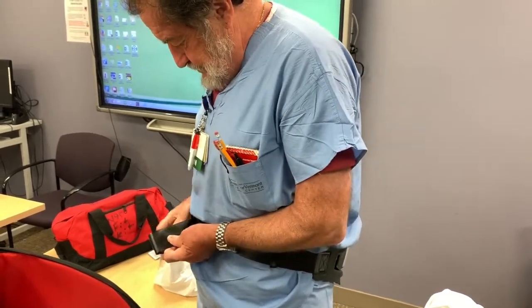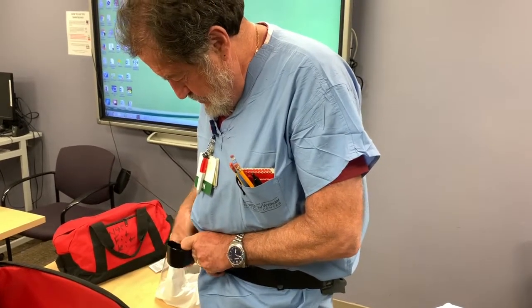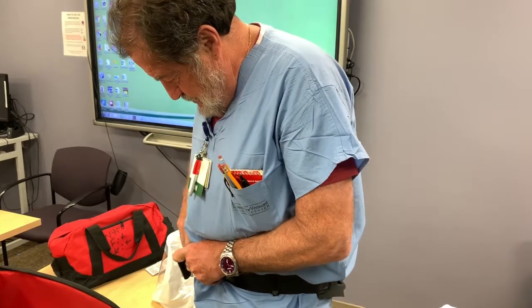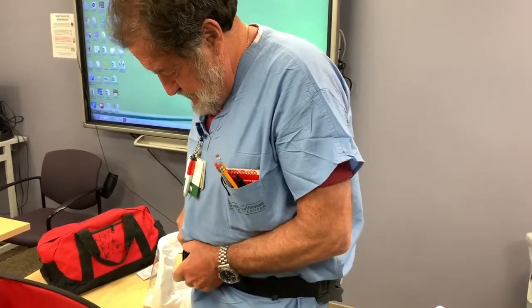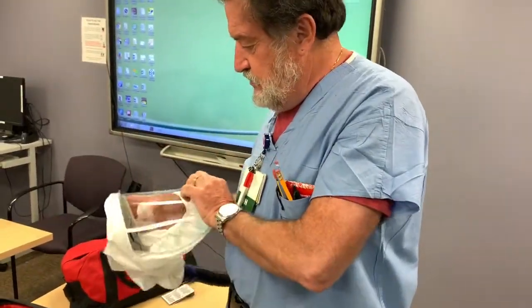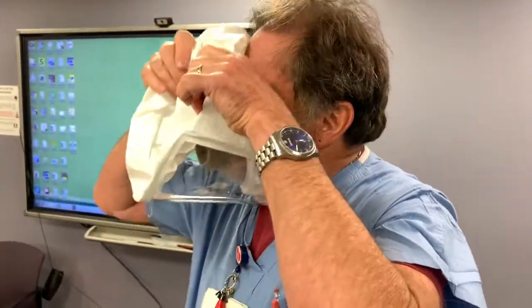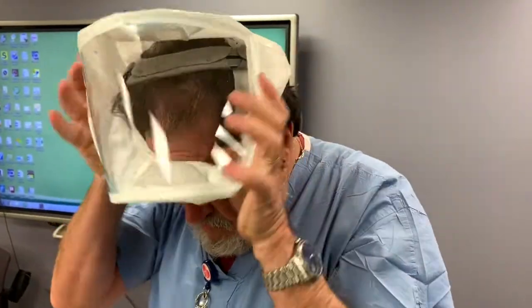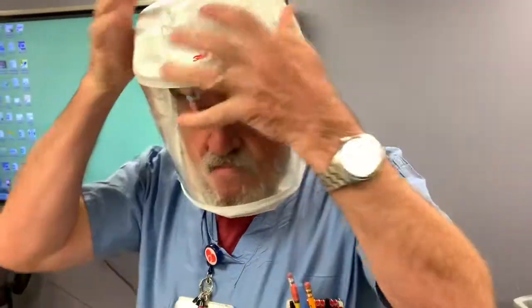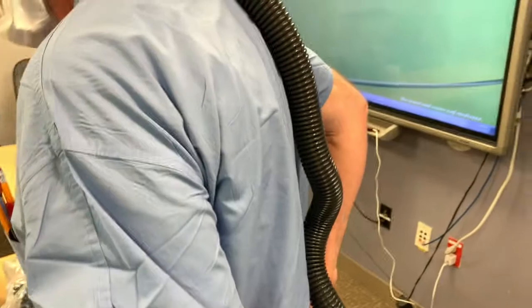So we're going to put it on. And then you just press the on button, which is back here. There's a blower button and an on button.